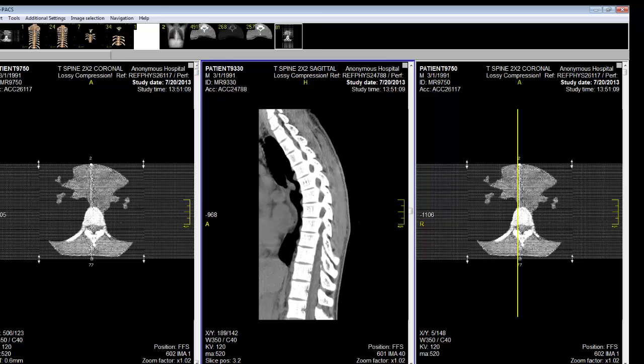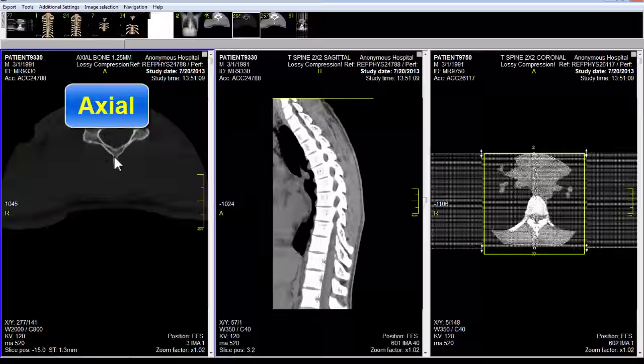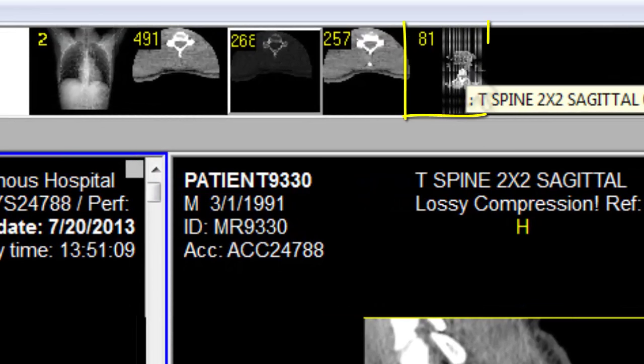Once the computer has set up the screen into three different tiles, then you have to load in the axial, coronal, and sagittal sections. So I'll start right here with the number nine image stack, click on it and drag it to the far left — this is where I will display my axial sections. Then I will go to image number eleven, which is T-spine sagittal, and click on it and drag it to the middle tile screen.